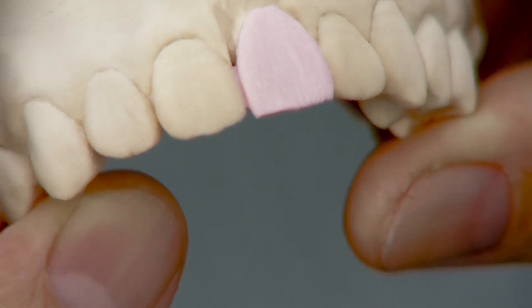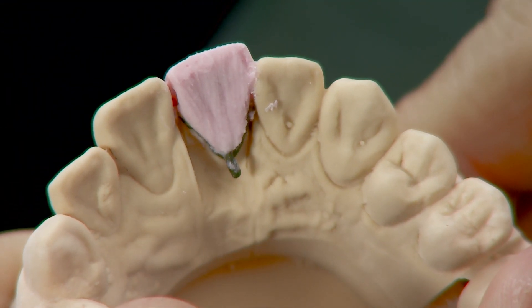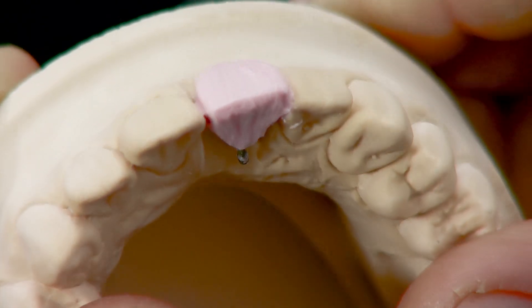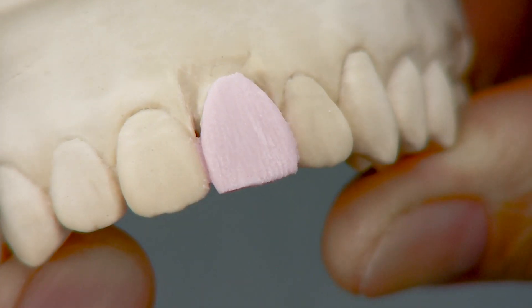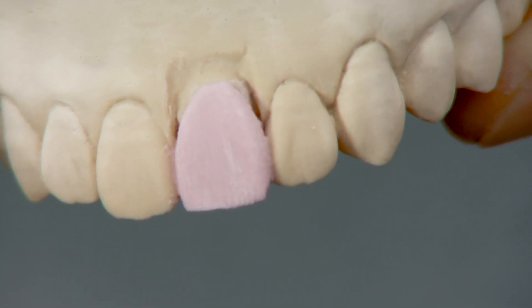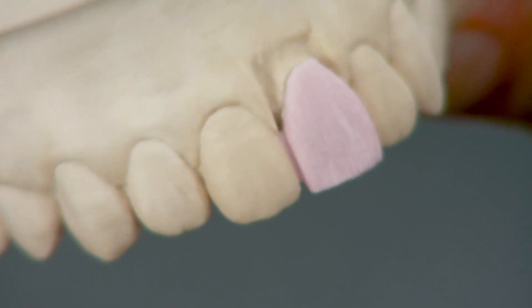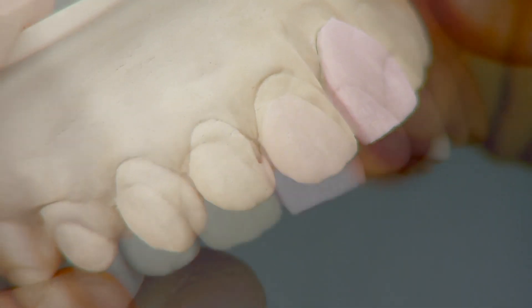Smoothen the surfaces with a porcelain brush and condense sufficiently by tapping gently with a hammer on the side of the model. The body porcelain now has to be cut back to allow sufficient space for the enamel layer. The tooth is built to the symmetry and dimension of the adjacent tooth — check the restoration from various angles to ensure correct length, thickness, curvature, and emergence profile.